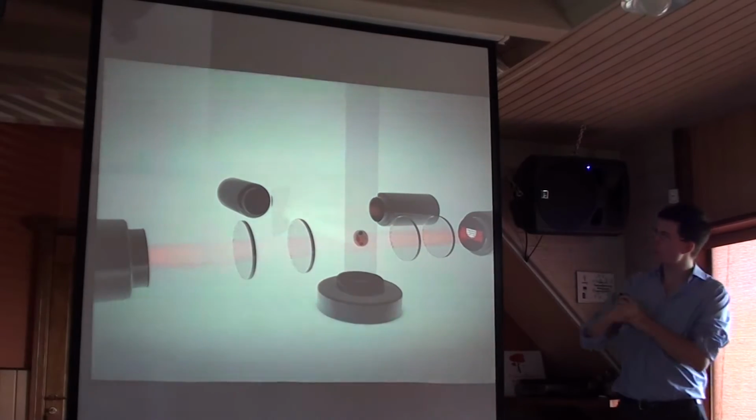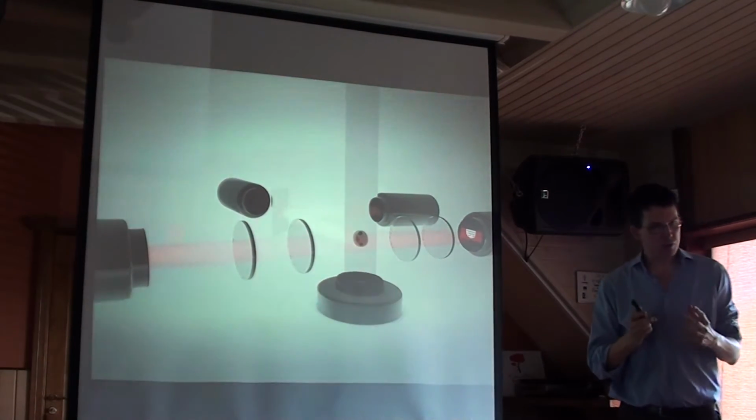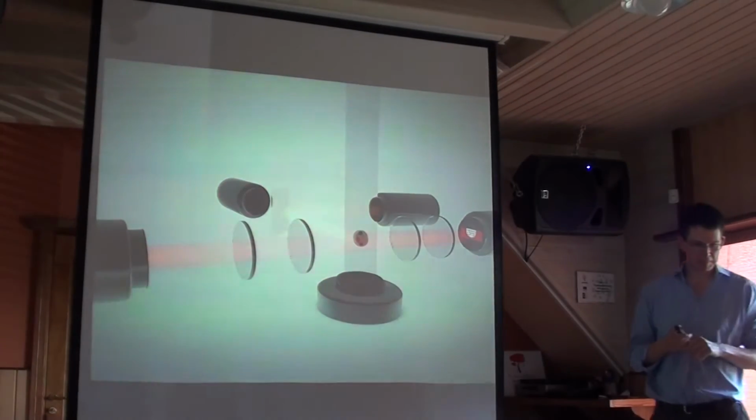So more recently, hematology analyzers have been based around a laser, and I suspect you won't be excited to see the insides of a laser-based analyzer.